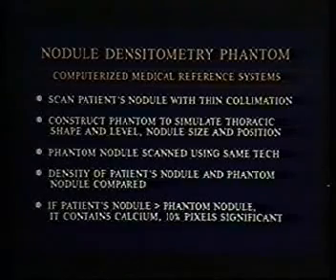Now, in studies using this phantom, it has been considered that if you see 10% of the pixels containing these high CT numbers, that is, quote, significant calcification.